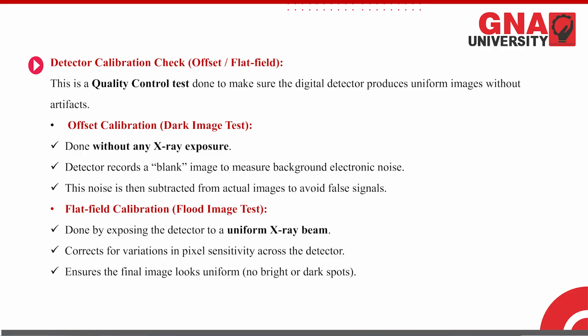But when we get it back, small black color dots are there, and sometimes small lines are there, and those lines are due to the background defect in the scanner, background defect in the printer. And this is known as offset calibration.